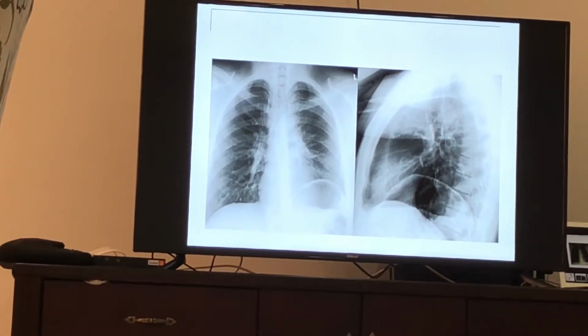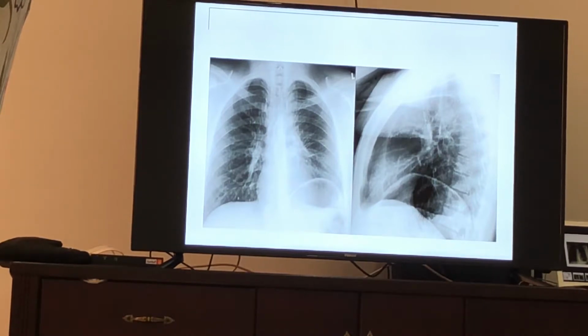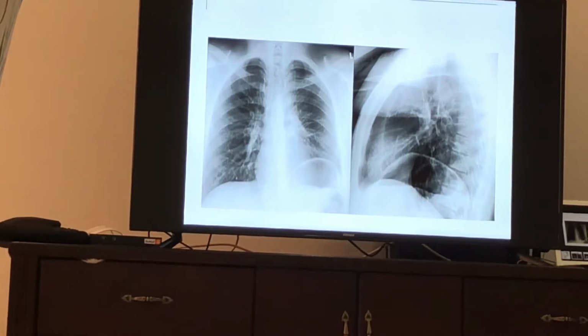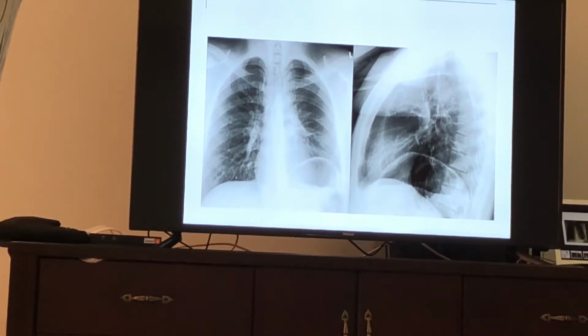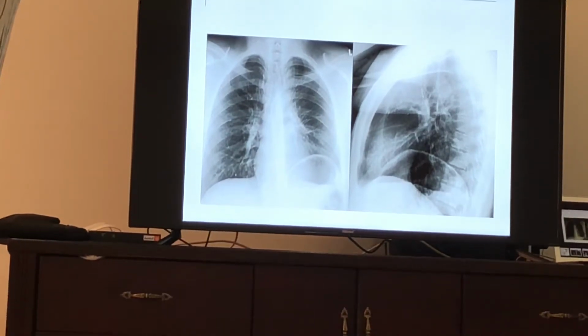You see the stomach outlined. Usually it's bilateral most of the time. I'm not saying it can't be unilateral. It can be unilateral pneumoperitoneum. That's what you're talking about. Pneumoperitoneum could be unilateral. Most likely to be bilateral. That would be one. Second of all, it's more dense. It's more jet black. The diaphragm won't be so raised like this, right? Doesn't matter. Could be. When the patient has an old problem and also has air.